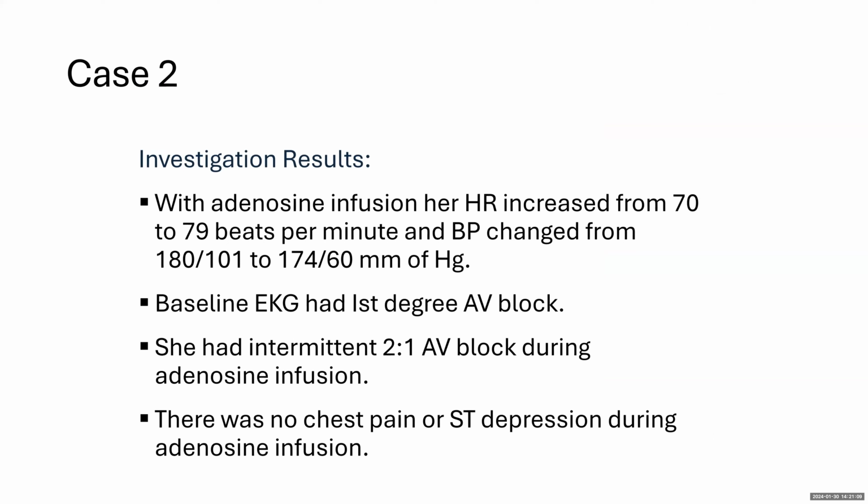One of the most important things, guys, even for your future, when you stress a patient, you have to really describe what was the response to that stress. Because maybe it's not enough as a stress. And I hope they don't really fool people in exams and give you an exam that is inconclusive testing.